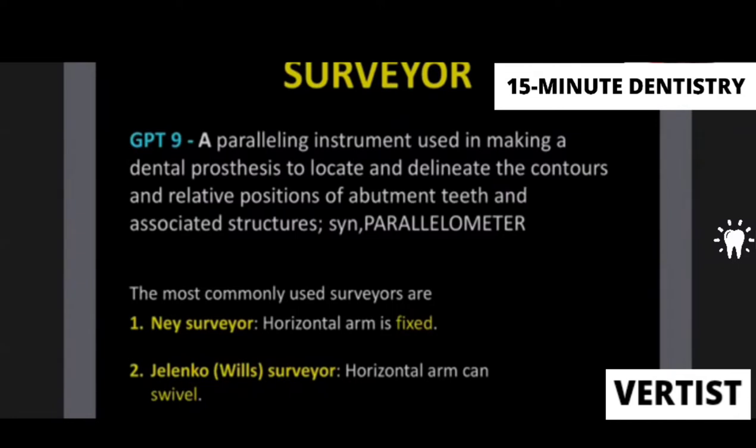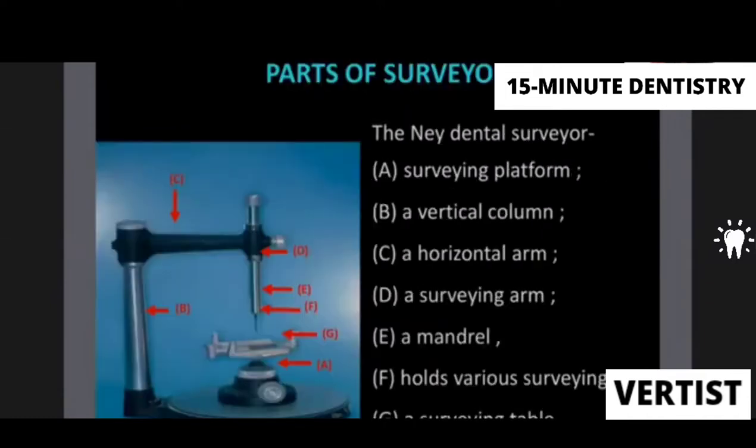So surveyor definition, and the most commonly used surveyors are the Ney surveyor and the Jelenko surveyor. That's the diagram. Beautiful diagrams have to be drawn. Practice them. I'm going to be telling you your 10 commandments at the end of this presentation, but that's how a diagram should look like. You must have on the right-hand side all the different captions which your diagram is going to be showing you. So that's how a surveyor looks like, and that's what are the different types of a surveyor.